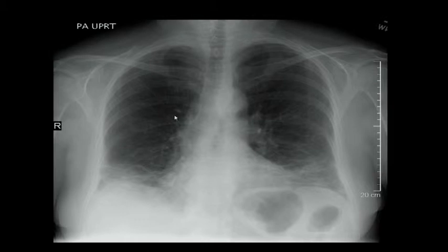All right, so you want to go with the bilateral lower lobe atelectasis? Okay. Anything else? If you can identify this structure. The minor fissure. So there's expansion of the upper lobe, there's total knocking out of the lower lobe right here.